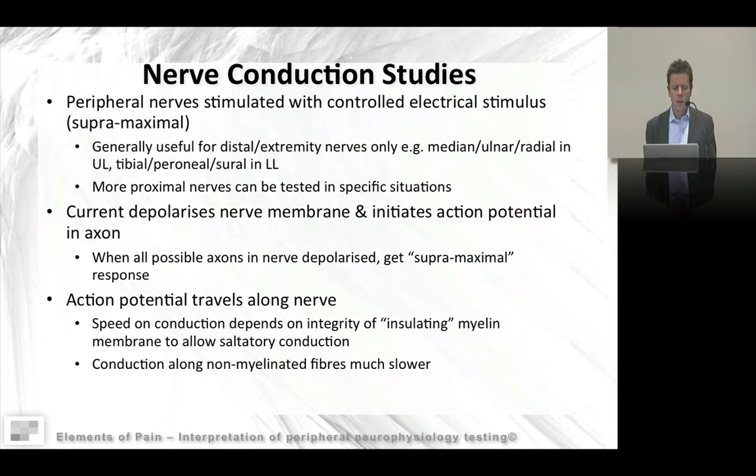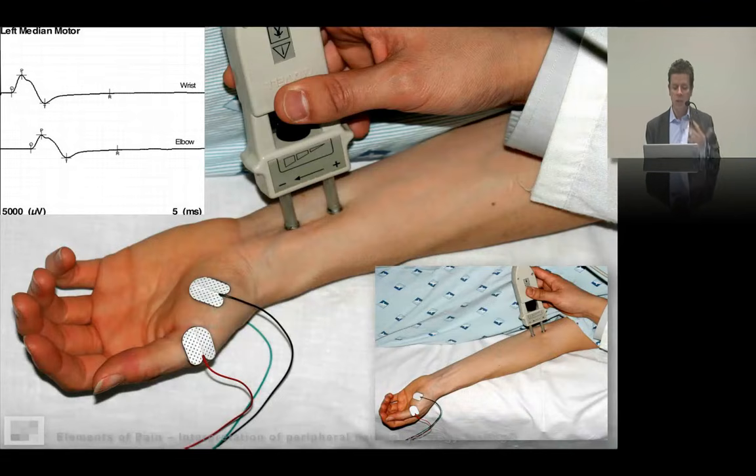So the understanding of these concepts gives some idea of some of the deficiency of the testing, particularly looking at problems where there might be unmyelinated fibres, which can be a particular aspect in pain situations, which often involve the small or unmyelinated fibres.